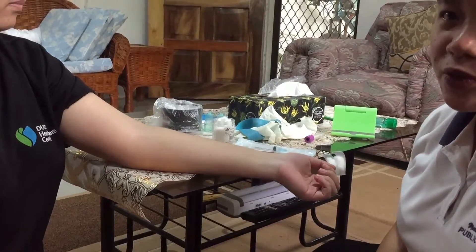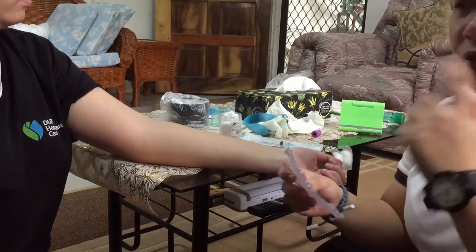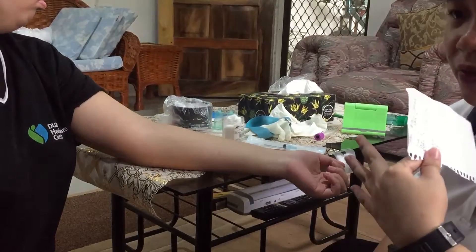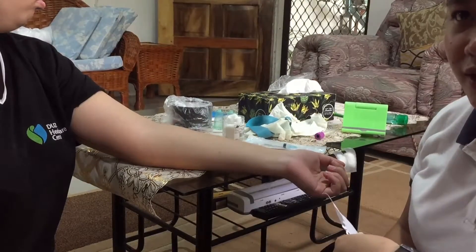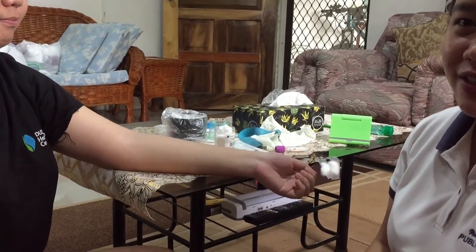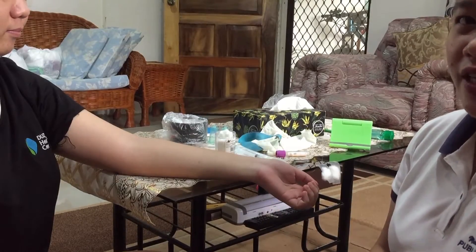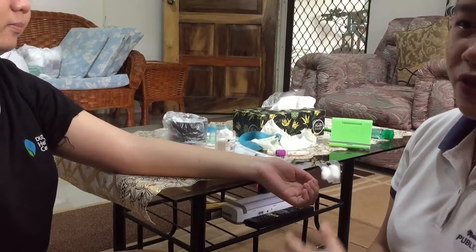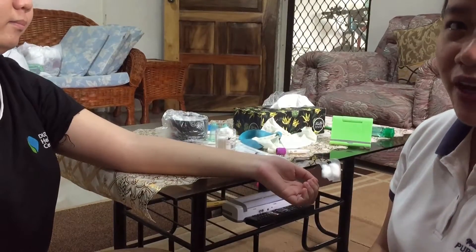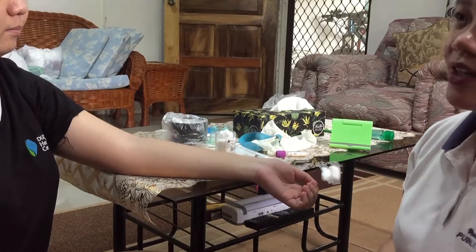The first thing you have to do is to correctly identify the patient. To do that, you'll need the laboratory request and then ask the patient to state his or her name verbally. After verifying the patient, introduce yourself as the medical technologist for the day and state what kind of test the patient will be having and what procedure you'll be performing.